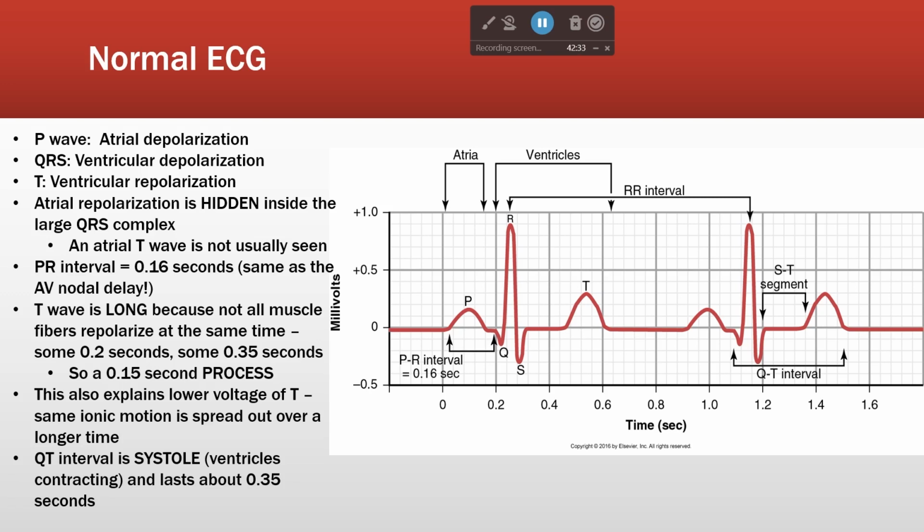This is ventricular depolarization. Now, one of the first things that you're going to see is that atrial depolarization is kind of wide and bump shaped, right? The QRS is pointy and very short. Why? Because the conduction through the ventricles is really fast. We talked about that.